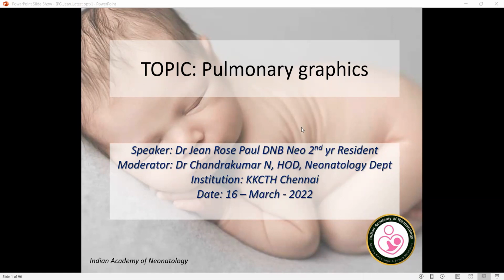So today we are starting with pulmonary graphics. So what is the importance of pulmonary graphics? Understanding the physiology of the normal lung, and understanding the pathophysiology of the diseased lung, and how respiratory support systems like the ventilators will help in this, should be better understood so that we can achieve the ultimate goal of neonatal ventilation, that is optimizing the gas exchange with minimal ventilator injury.